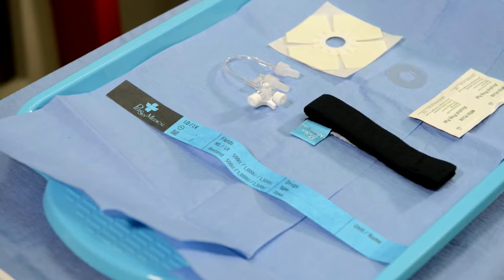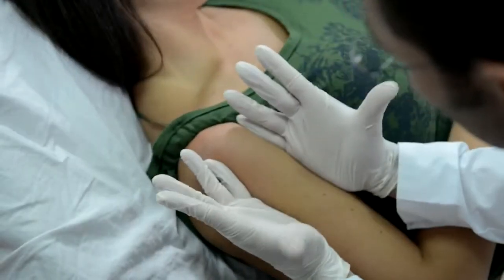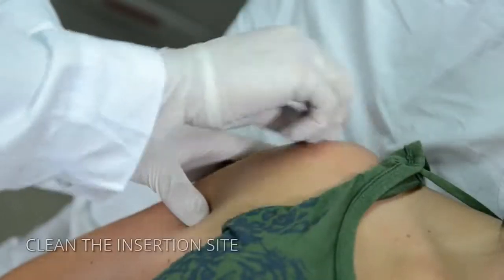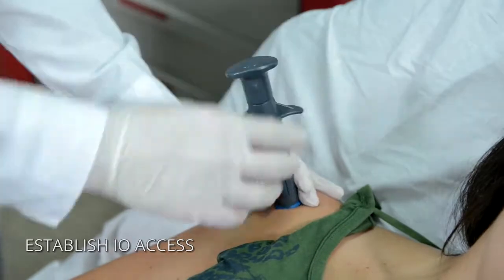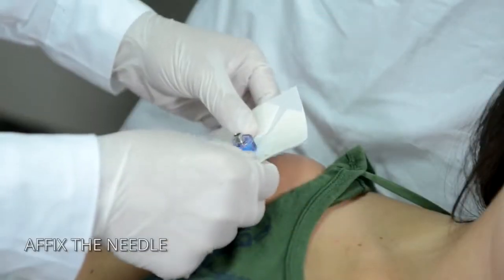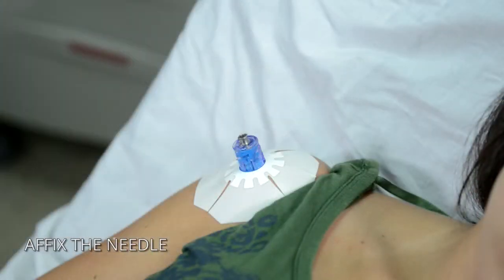Select the appropriate insertion site and use prep pads to clean the area. Deploy the neo to achieve IO access. After insertion, utilize the neo fixation to immediately affix the needle stabilizer to the insertion site.